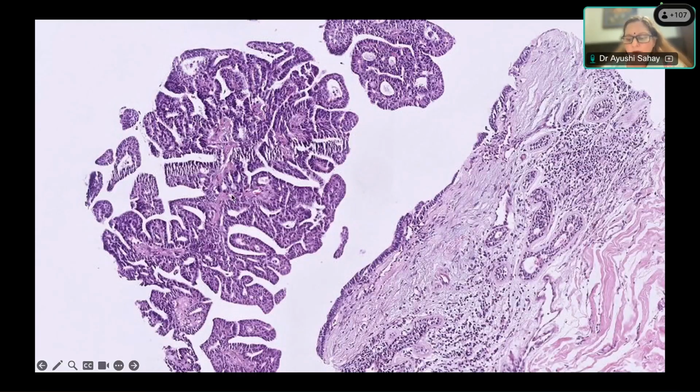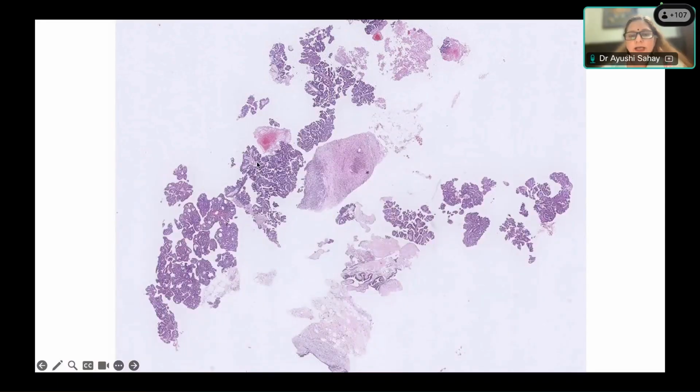Basically, you have to check what you are having in the biopsy, are you having only the cores, or are you having also in the cores the periphery of the lesion. So the cores are comprising only of the lesion, or do they also show the periphery of the lesion?